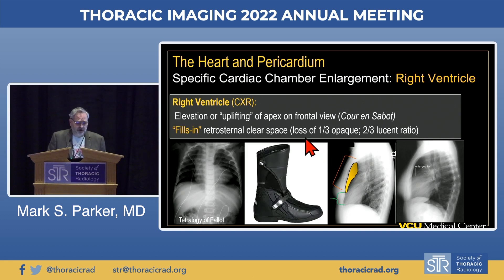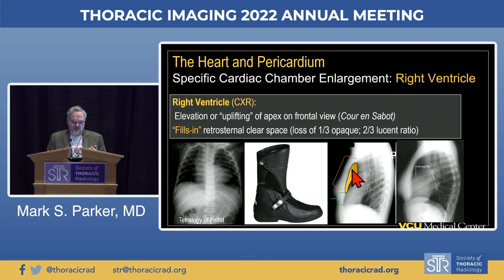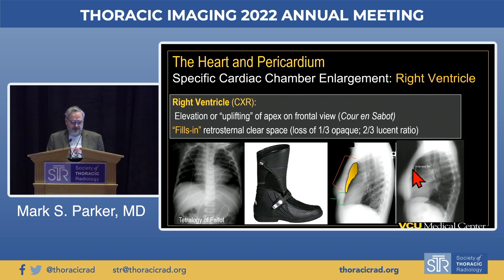On the frontal examination with RV enlargement, we'll see uplifting of the apex, and the myocardium assumes a boot-shaped heart or coeur en sabot—classically seen with tetralogy of Fallot. On the lateral examination, we lose the normal one-third opaque, two-thirds lucent relationship behind the sternum as the RV enlarges and encroaches upon the retrosternal clear space, as seen in this patient with cor pulmonale.